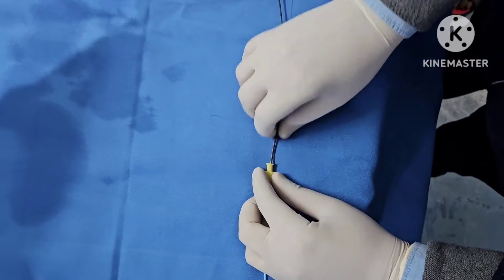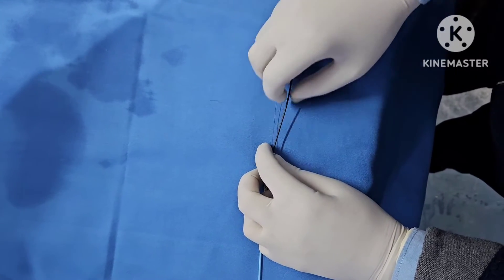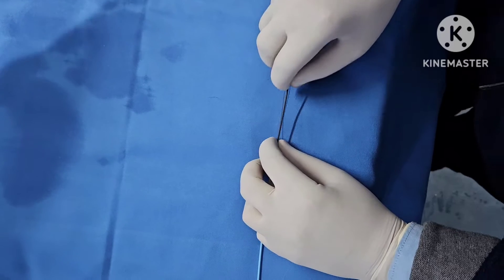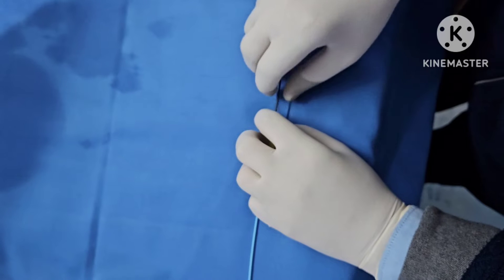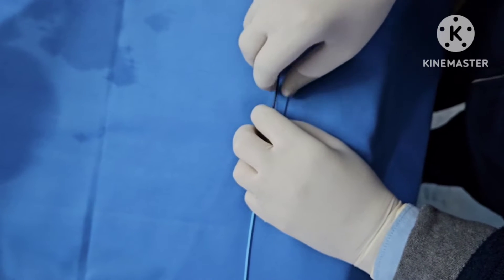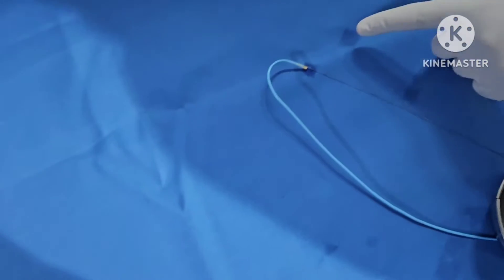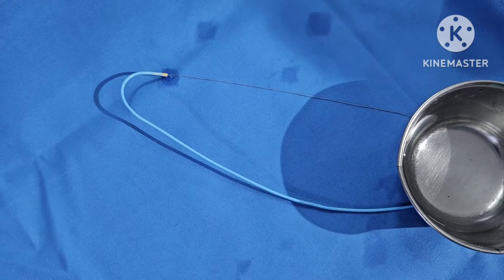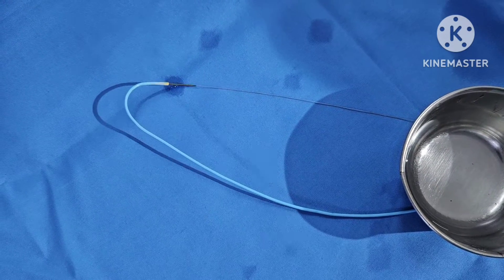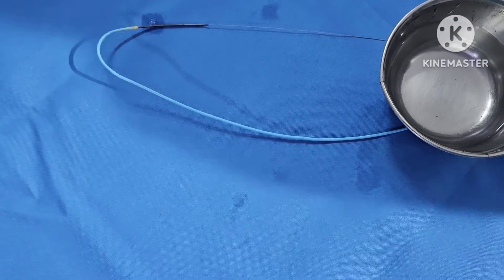Okay. As you can see the catheter, we are using an EBU catheter. XB, sorry. Yes. So XB till the catheter comes, the thrombus aspiration comes out of the catheter, like so. Kindly show the face of the bar. Yes. So the thrombus aspiration catheter is going to come out. Yes. So it has come out. So we are going to place this thrombus aspiration catheter there only.